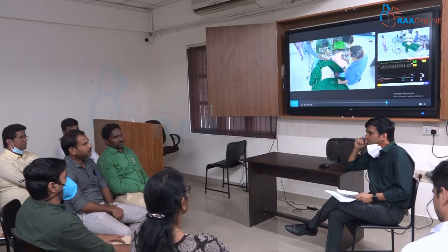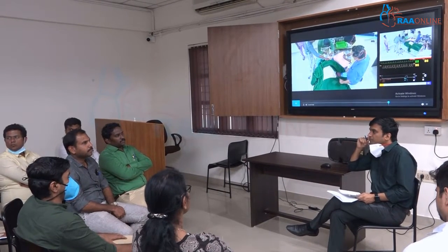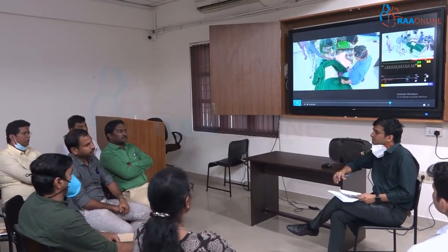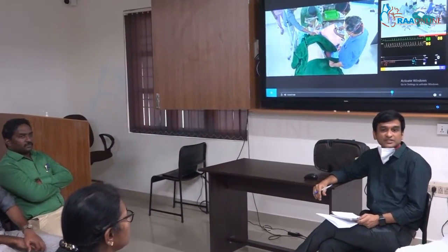So that depends upon the hemodynamics of the patient, and what saturation level is maintained. Any other thoughts from your end? 10 seconds, okay. Any thoughts from the senior people here? Saturation. If the patient doesn't want his ICP to be raised, or is a hypertensive patient, the recommended guideline is less than 15 seconds of scoping time. I totally agree with that. So 15 seconds might be a good enough time for us to decide whether we need to persist with the scoping or we need to go back.